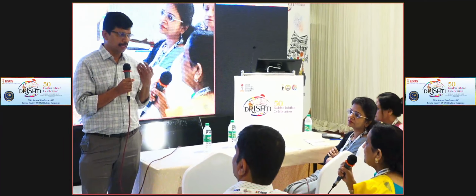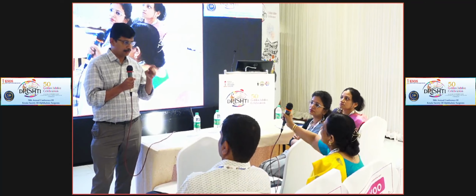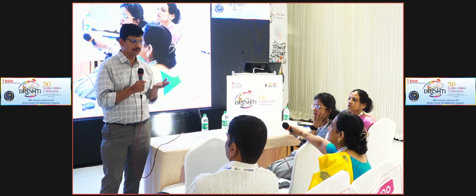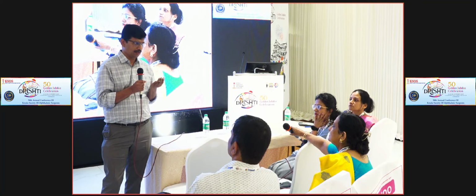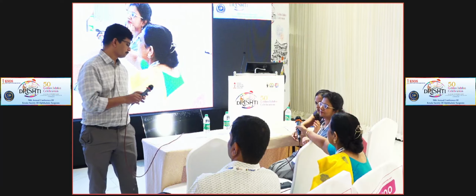So in my hands, I mean your visualization of the posterior segment. Yeah, that is one more thing, because after the surgery with a sclerofixated lens, there is hardly any difficulty in visualizing the posterior segment after surgery. Dilatation is not that difficult.